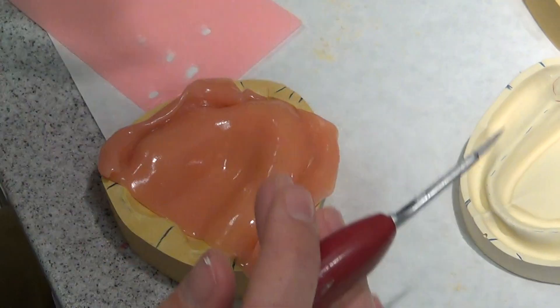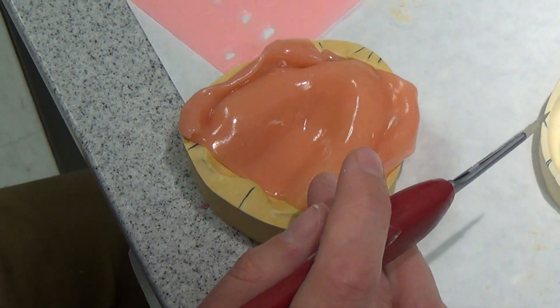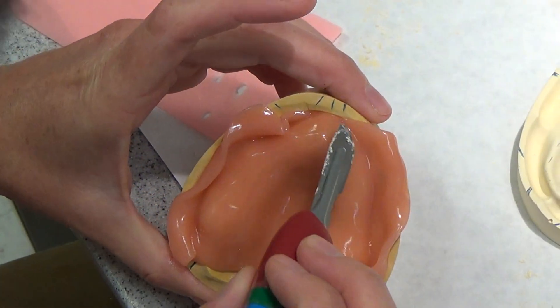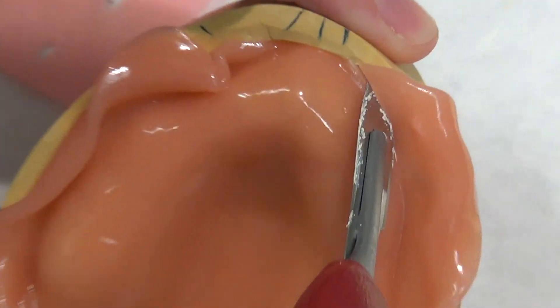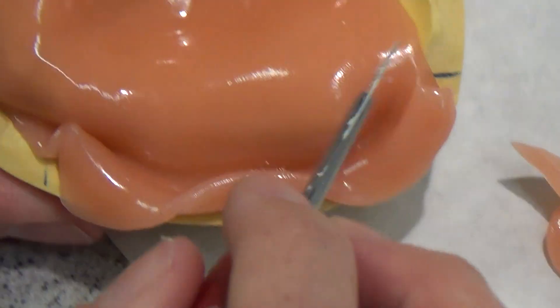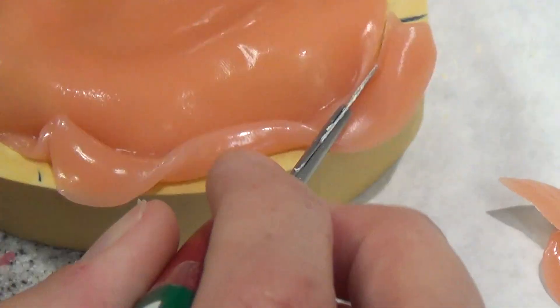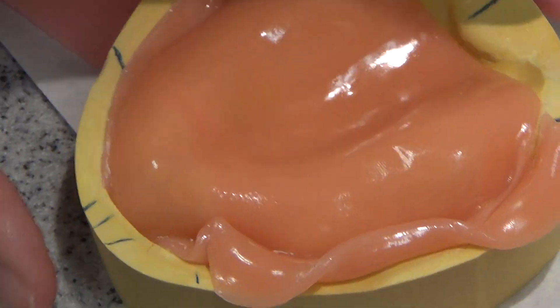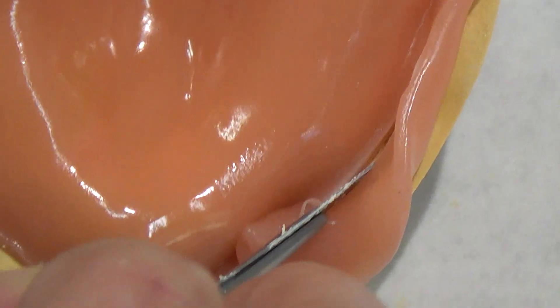I'm going to take my 20 blade and come back around the land area and trim this pretty close to where I want to be. I'm trimming it at the land area all the way around, and I'm just going to get rid of this excess because I don't need it.